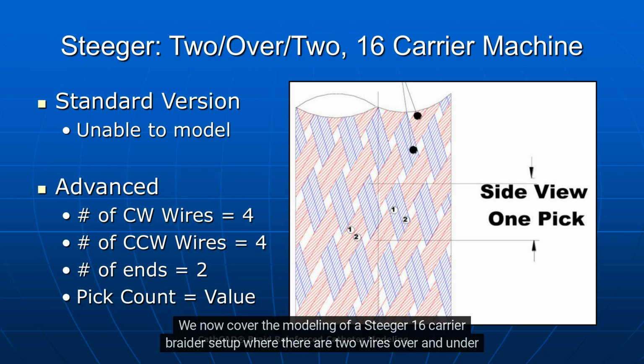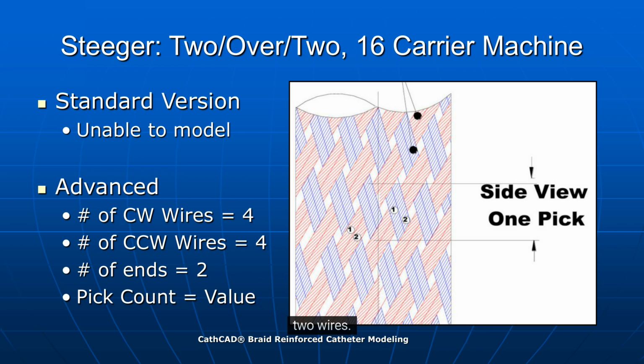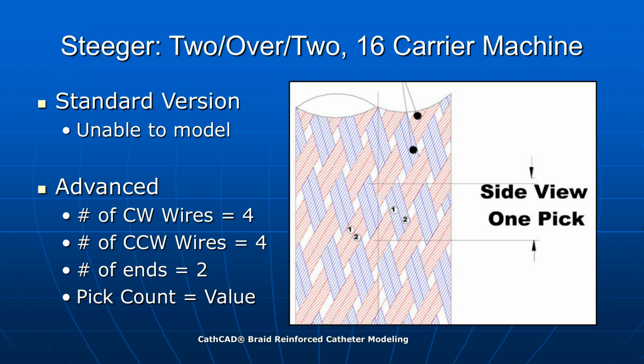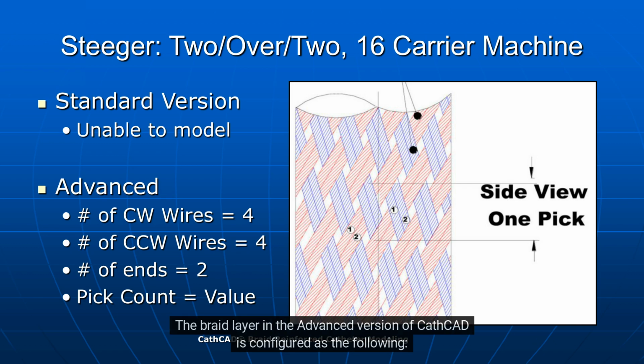We now cover the modeling of a Steger 16 carrier braider setup where there are 2 wires over and under 2 wires. This configuration is referred to as a diamond pattern. The preferred method is to use CathCAD Advanced for this braid pattern modeling. The braid layer in the advanced version of CathCAD is configured as the following.